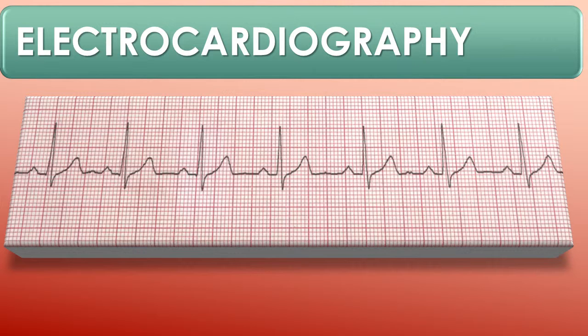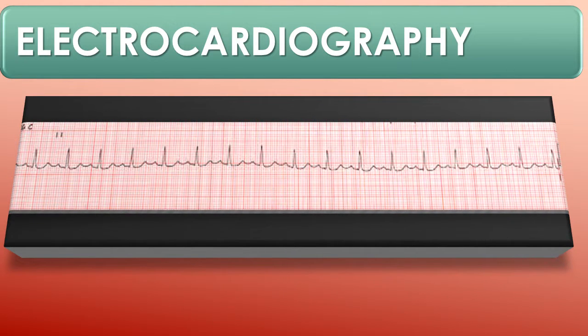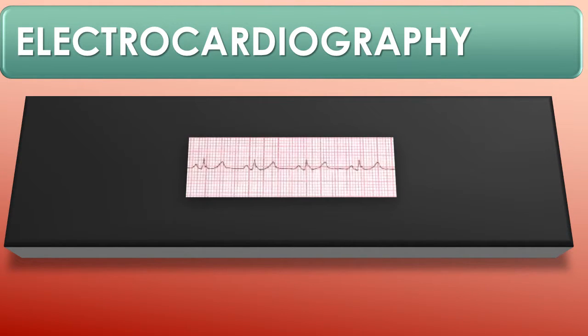Electrocardiography, or an electrocardiogram, then is a graphic representation, or a picture, of the cardiac electrical activity. A lead provides one view of the heart's electrical activity. We can get multiple leads. Electrode placement for males and females is the same.